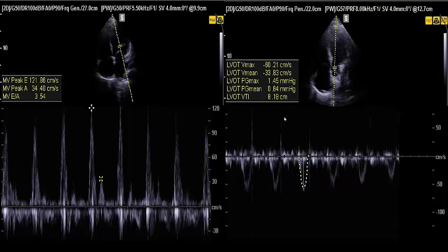Beta blocker decreases the heart rate, so it increases the shock state by decreasing the heart rate, because cardiac output equals stroke volume times heart rate. Stroke volume is very low here, and also heart rate is low for the patient, so this worsens the state of shock. So I have here the bradycardia as drug induced and severe left ventricular dysfunction as a cause of this severe low stroke volume and low cardiac output state.